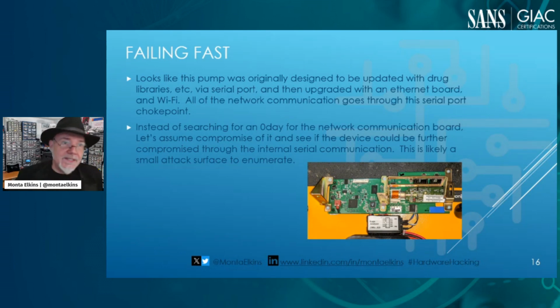And if I was looking at this pump from the beginning and just wanted to do a security analysis of it, and there wasn't any existing vulnerabilities published, I might plug into where that communication board talks to the rest of the pump. And that's what I've done here using this kind of cheap logic analyzer. And I'm looking at the serial communication back and forth.